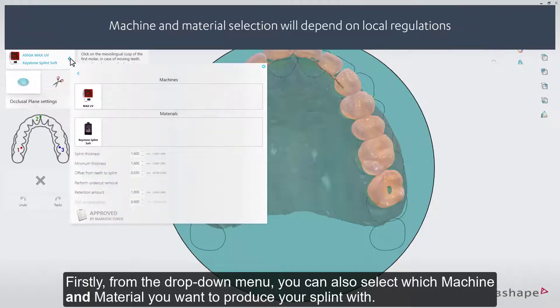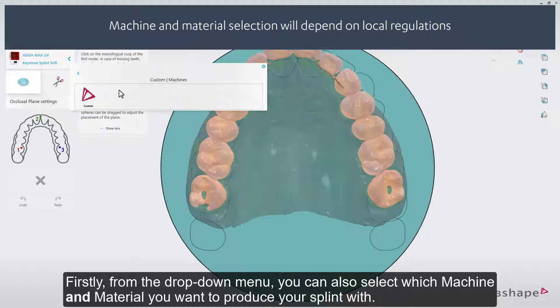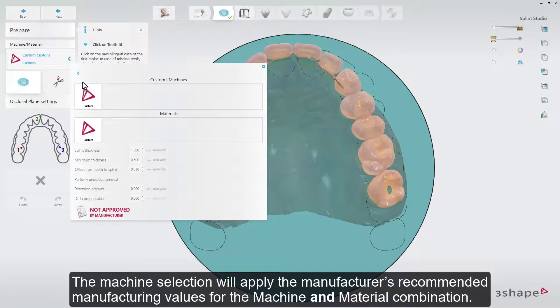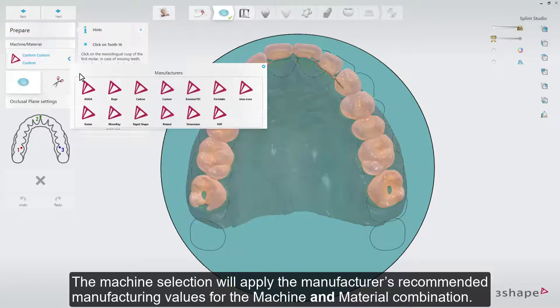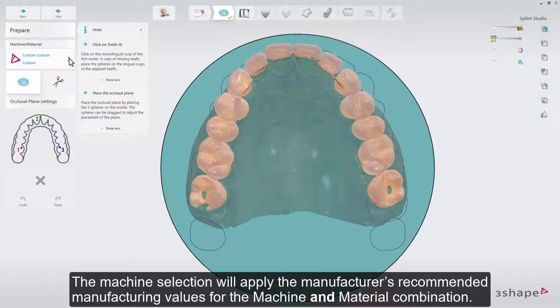From the drop-down menu, you can select which machine and material you want to produce your splint with. The machine selection will apply the manufacturer's recommended manufacturing values for the machine and material combination.